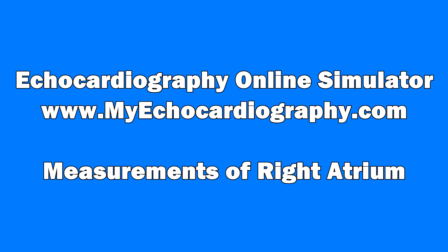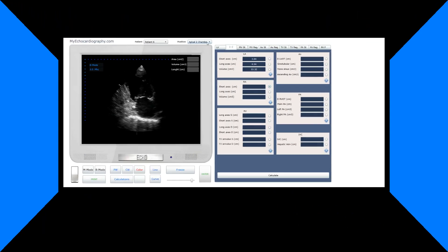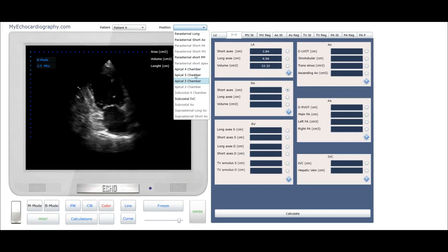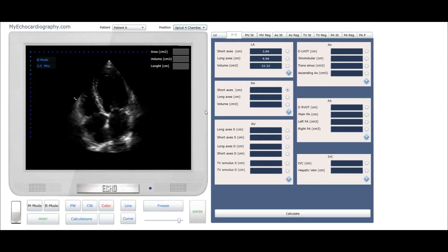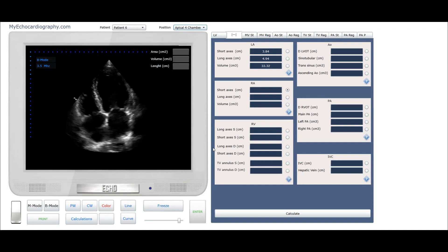Welcome to transthoracic echocardiography online simulator myechocardiography.com. From the list select apical four-chamber view.